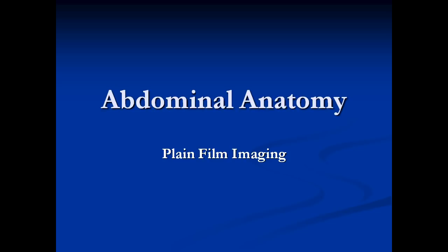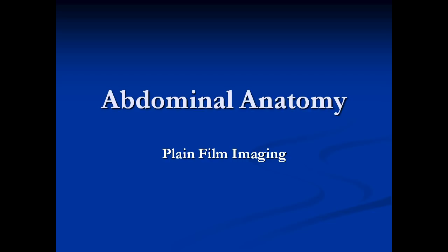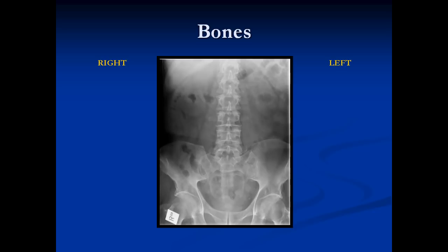Now we're going to take that anatomy from CT and try to see it on abdominal plain film imaging, which is a little more difficult. This is a plain film of the abdomen — a supine view. In the center we have the spine with lumbar vertebrae and disc spaces between them. This is the bony pelvis, the sacroiliac joints on each side, the hip joints, and the symphysis pubis.